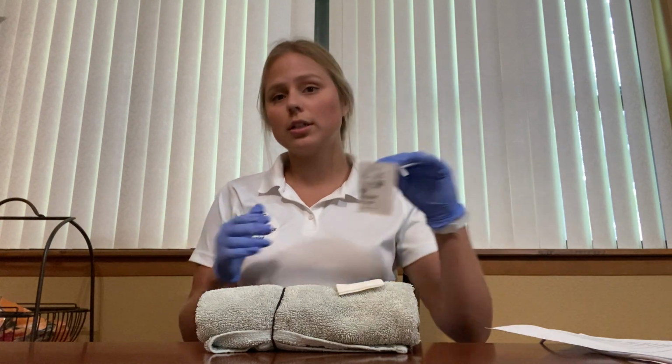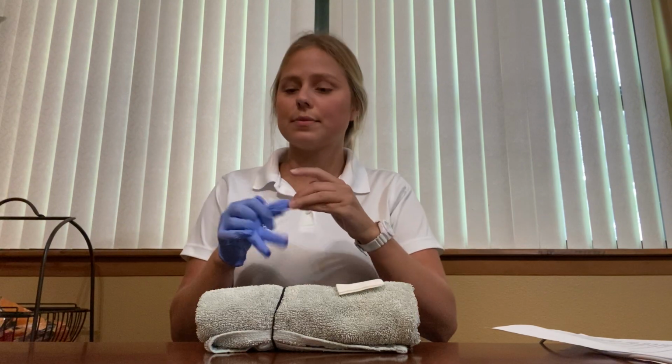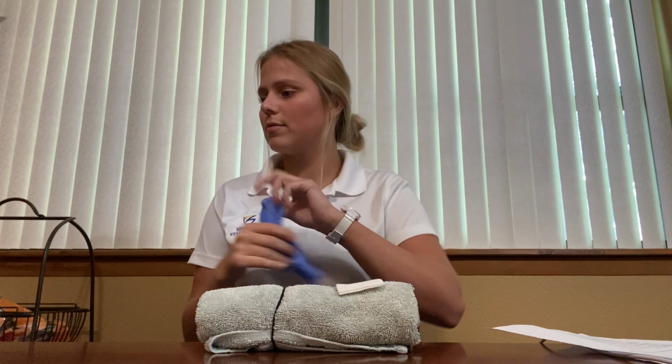Then I'm going to discard any supplies, clean up my environment, remove my gloves, wash my hands. Then I'm going to do any necessary documentation. So I'm going to document that the medication was given, document any assessments I did, and then I'm going to assure a safe environment. So I'm going to make sure the bed's in the lowest position, no clutter, call lights in reach, and then I'm going to make sure the patient's comfortable.